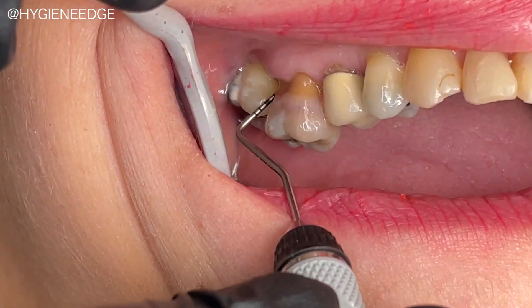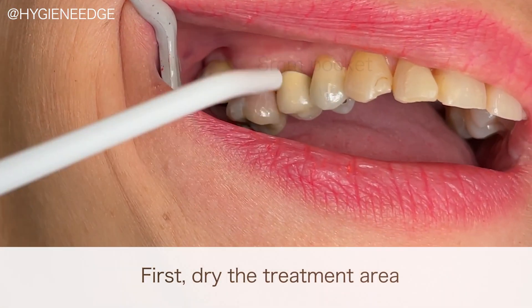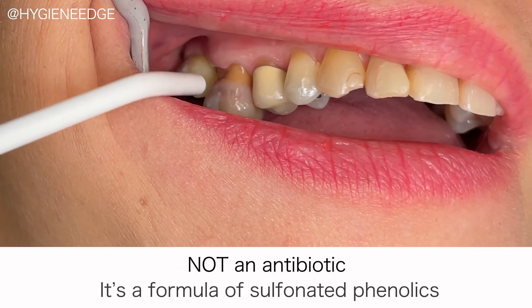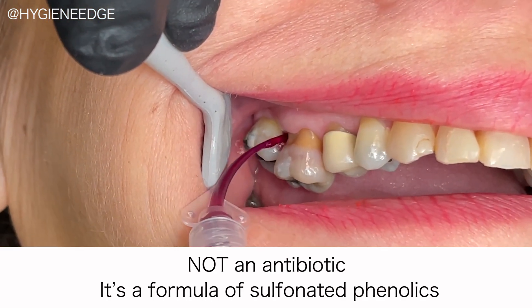Hybenex is really easy to use. First, dry the treatment area as thoroughly as possible. As a reminder, Hybenex is not an antibiotic — it's a formula of sulfonated phenolics. With antibiotic resistance on the rise, antibiotic stewardship is more important than ever.